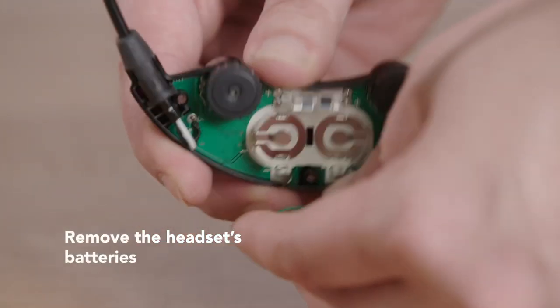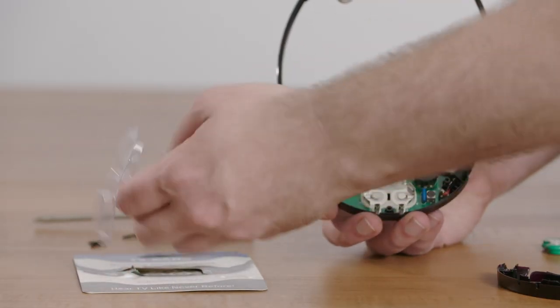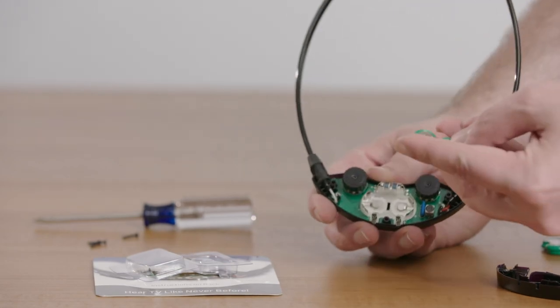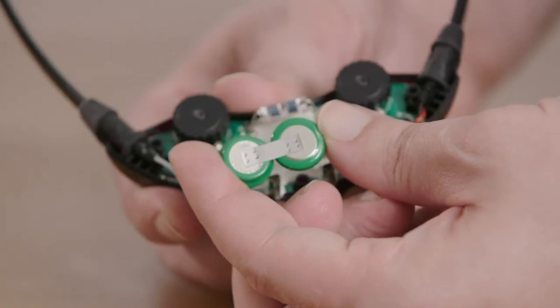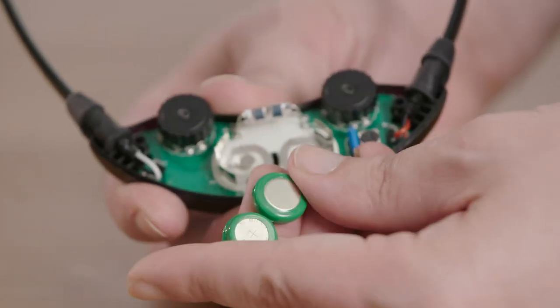First thing we're going to want to do is remove the old one. Then take our new battery. You may notice that one side of the battery has this metal plate running between the two round batteries and the other doesn't.